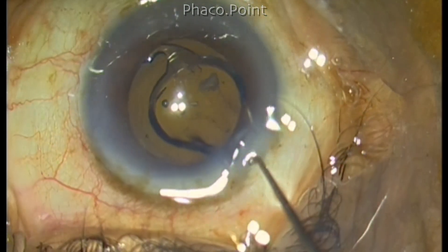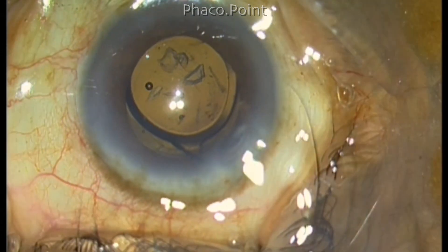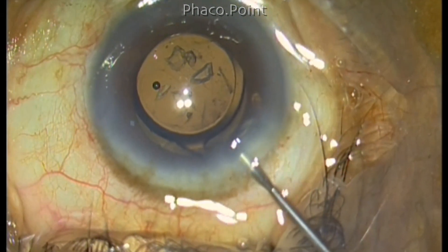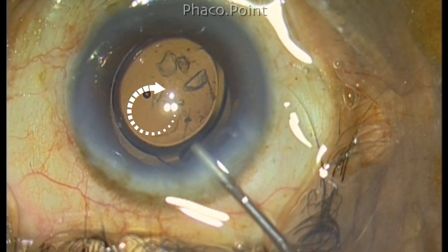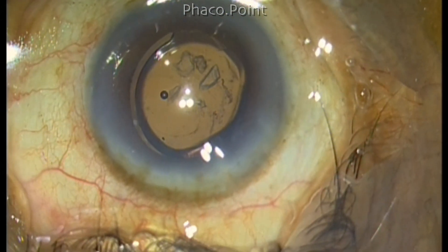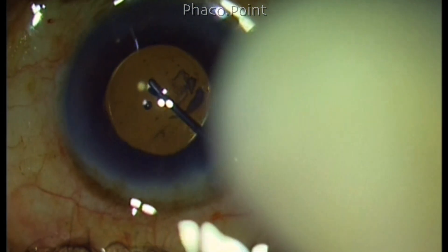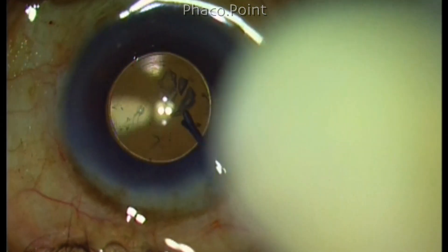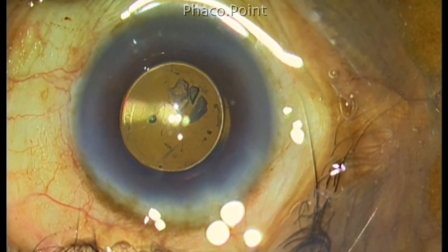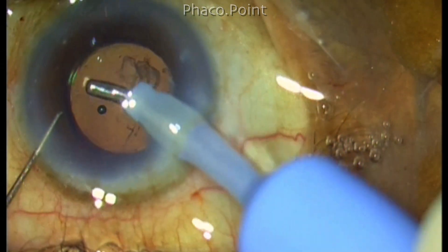In spite of this, there was no increase in the size of the small punched-out opening in the posterior capsule. We see the opening in the posterior capsule is round and it has not increased in size. So I deepen the anterior chamber with viscoelastic and then, making use of a Y-hook, I engage the optic-haptic junction and tuck the trailing haptic inside the capsular bag very gently. The lens is now in the capsular bag and you can see the overlap of the anterior capsule over the optic. The anterior hyaloid face is intact in this case.